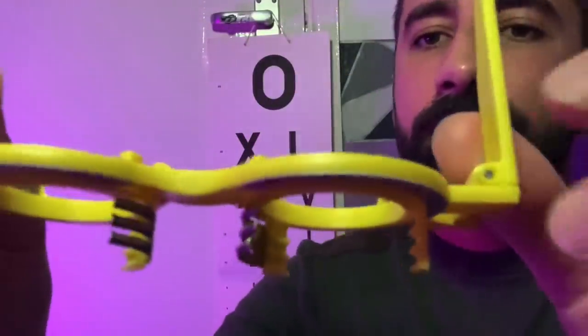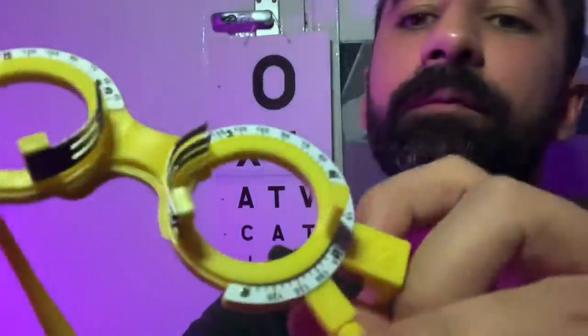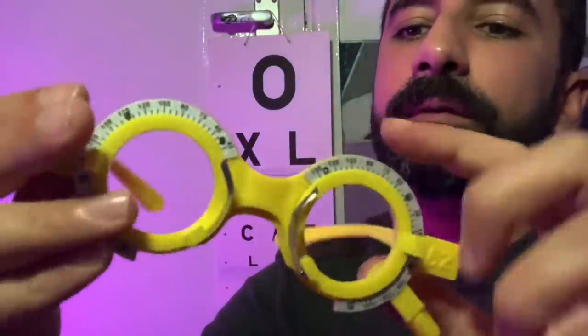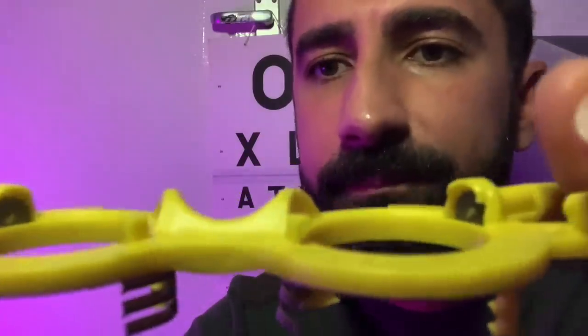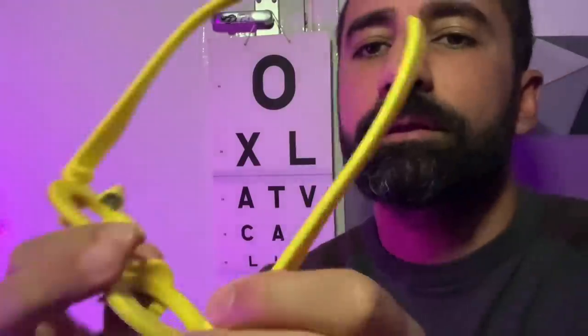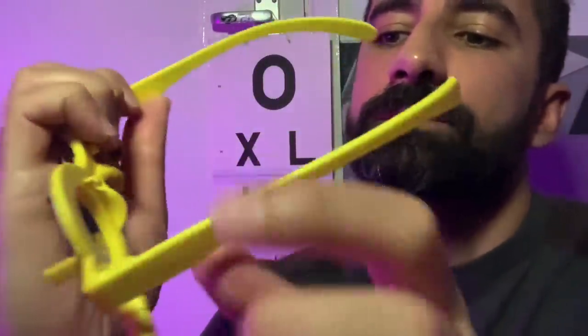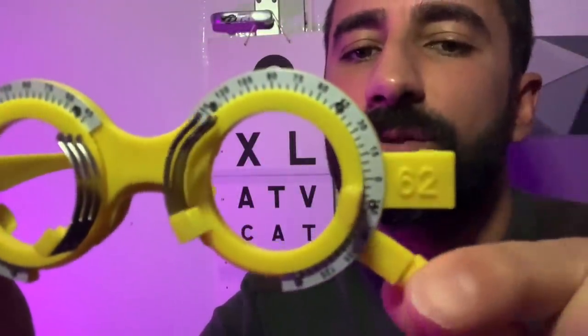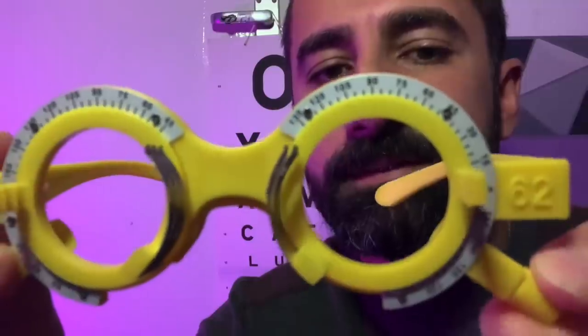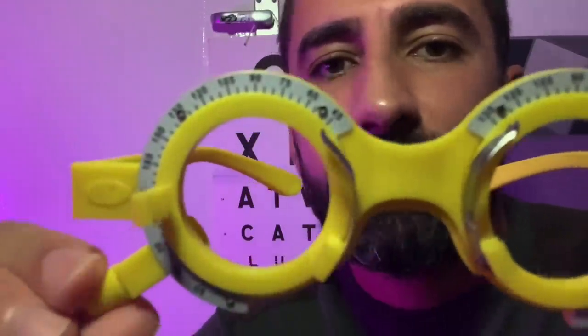We have three areas here, so we can hold three lenses in place, potentially, in those grooves there. The metal supports here. We also have a slot at the rear of the frame, if we need to place some lenses there. The length to bend is preset, but these have a wraparound design, so they'll stay on your face much more easily, so we won't have to do any adjustments to the sides of the frame. We also have the twizzle here for rotating lenses when we're checking your astigmatic element.